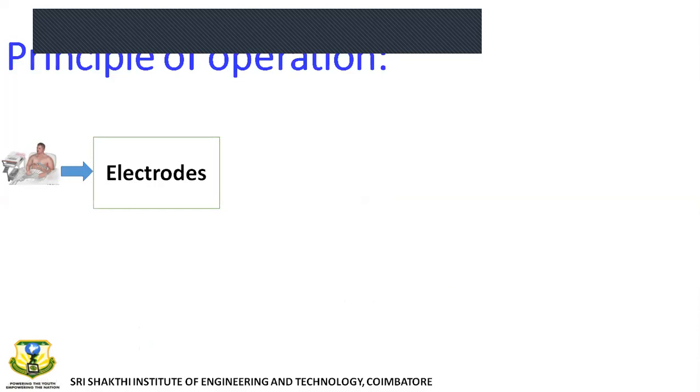So from there, it means the electrodes are connected. Here you can follow my cursor. So the electrodes have been connected. Any biomedical recorder will have an electrode.